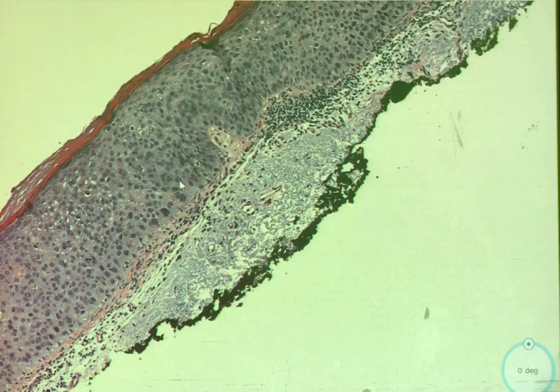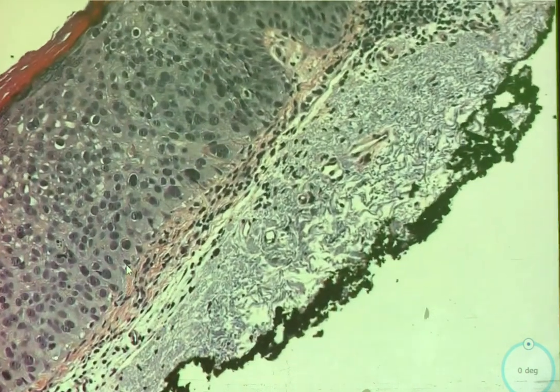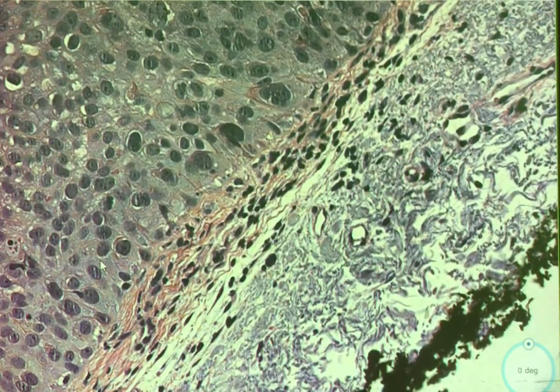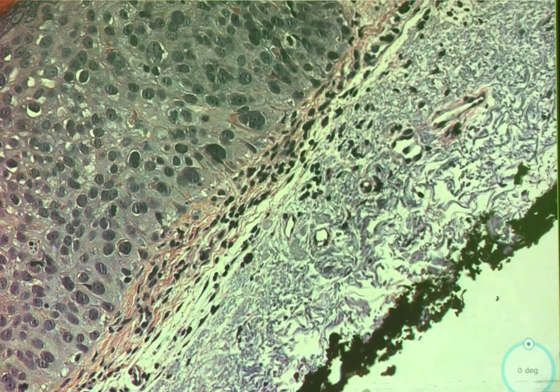And usually in normal skin, the size of the nucleus should be smaller when we go higher. Yeah. But here, for me, it looks like still large for being on the top. Excellent. And what about the shape of the ones at the bottom? At the bottom? They are atypical. They don't look like basal for me. They are more spindle. Like expanded? Expanded. Okay, I was just going to say they're big. Yeah, they're big. These are ginormous. I promise you, there are no trick questions. But some of them are big. Some of them maybe aren't round. These are huge.